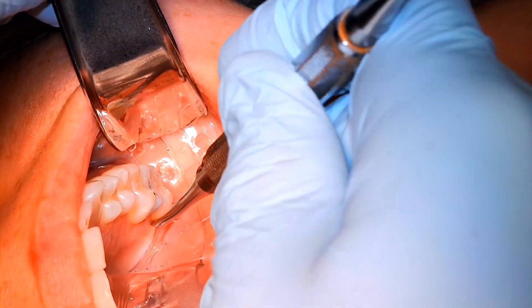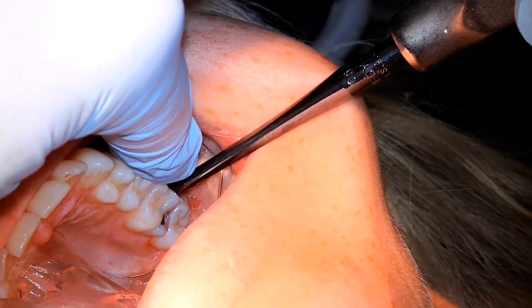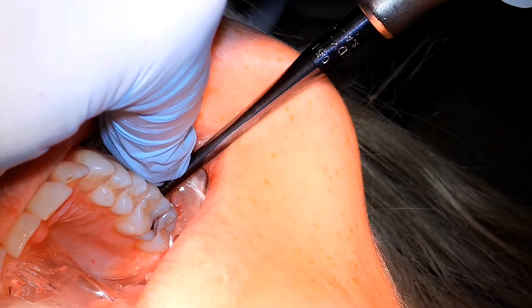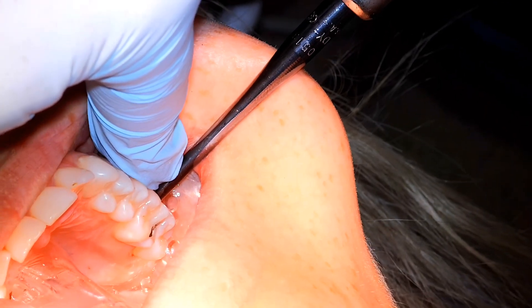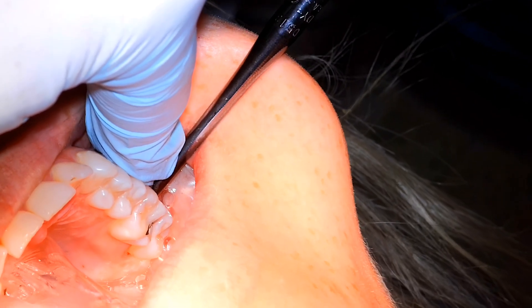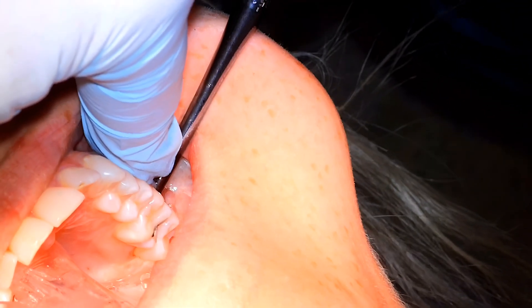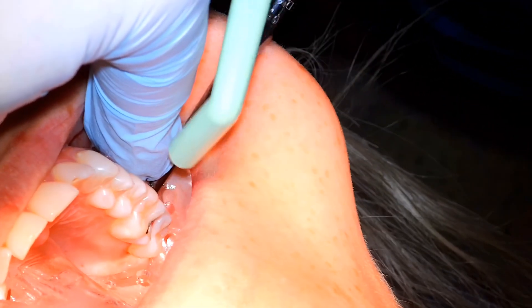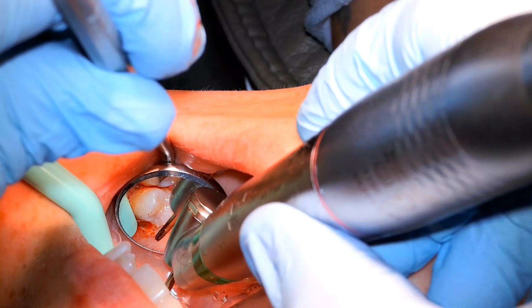I'm just lifting up the buccal tissue a little bit and freeing up the tooth by pushing on that distal buccal, applying a bit of pressure. This is the 3mm luxator on the mesial buccal aspect of that tooth. The tooth is moving a bit, but not a ton. You don't want to be super forceful because too much pressure can end up fracturing away some bone back there. The tooth lifts up a little but it's not quite delivering, so we're going to switch our plan of attack.